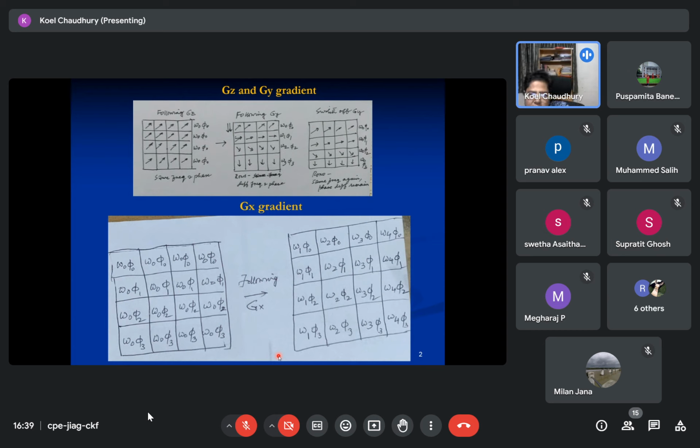But what is the uniqueness after this is complete? Each square will have a unique frequency and phase. Very good. Each voxel, which is represented as a pixel, is characterized by a unique combination of frequency and phase. Imagine how much effort it took the physicists to come up with this theory, because of which today we have the MRI. Now it is only theory.